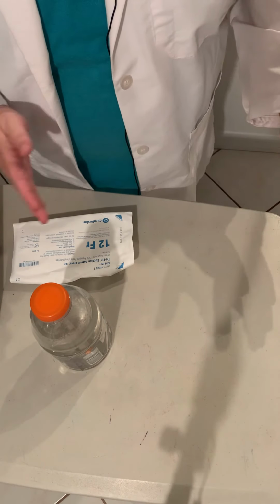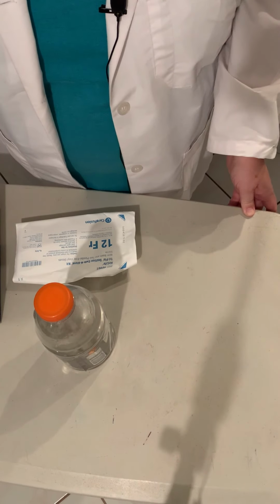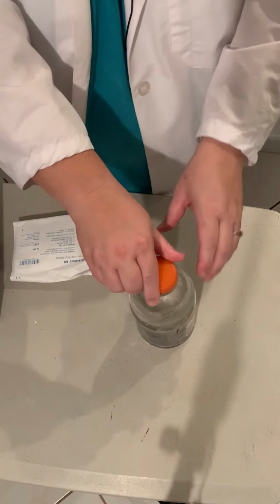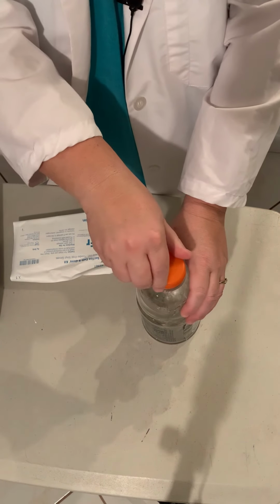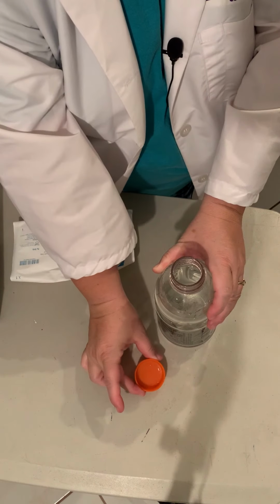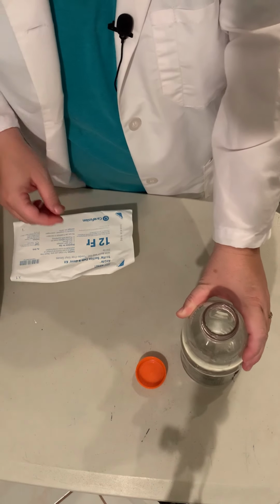So make sure your table is over far enough that you're not going to be turning your back to your sterile field. All right, so we're going to start by opening up our sterile saline. So we're going to twist that cap off and we're going to place it on the table upside down so that we don't contaminate it.